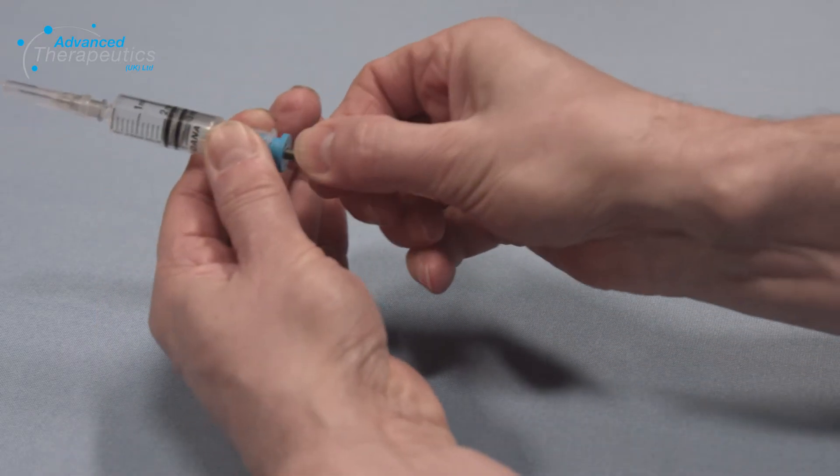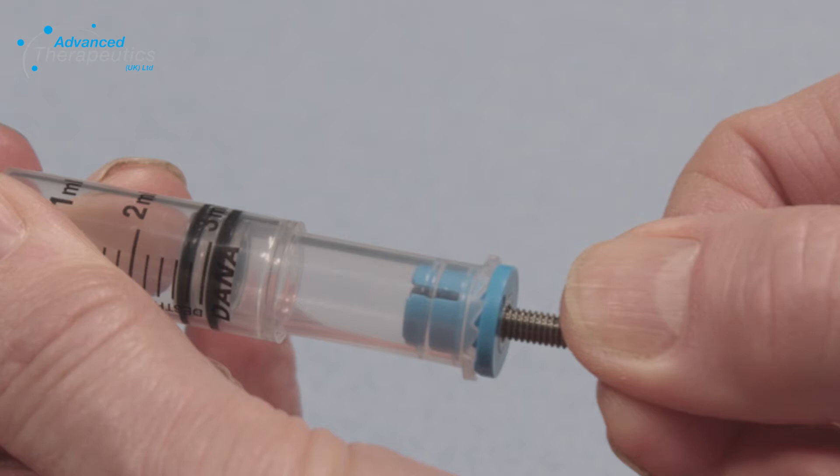Insert the linking screw into the new reservoir, ensuring the two plastic teeth fully engage with the serrated end of the reservoir. It should firmly click into place.